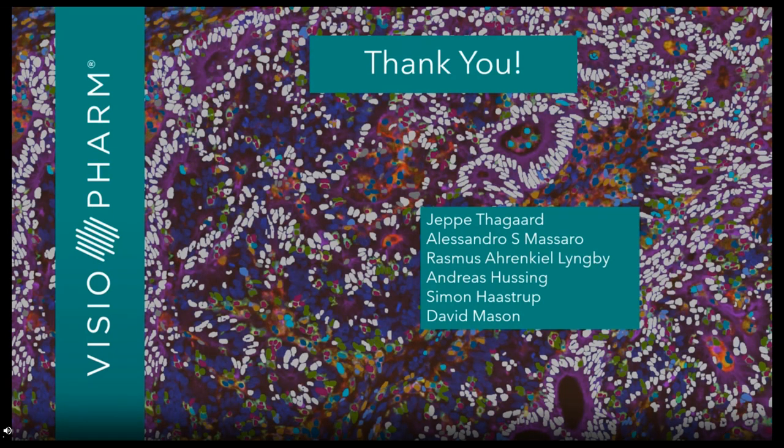Yes, so antibody stripping is something that we don't do at all. So basically we perform one single incubation of primary antibodies. So everything happens simultaneously. We do not need to do sequential staining, and therefore we do not need the antibody stripping. And this is something that can really affect the antigenicity of your tissue as well as the tissue morphology, which we try to avoid completely.